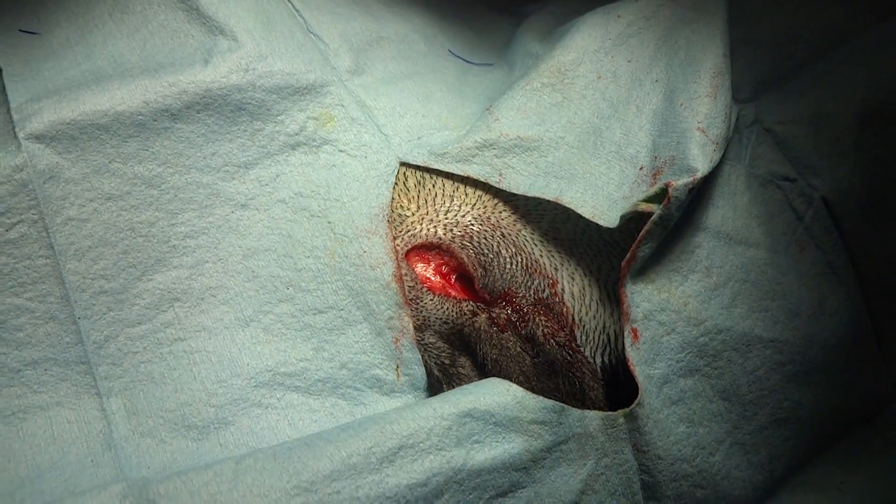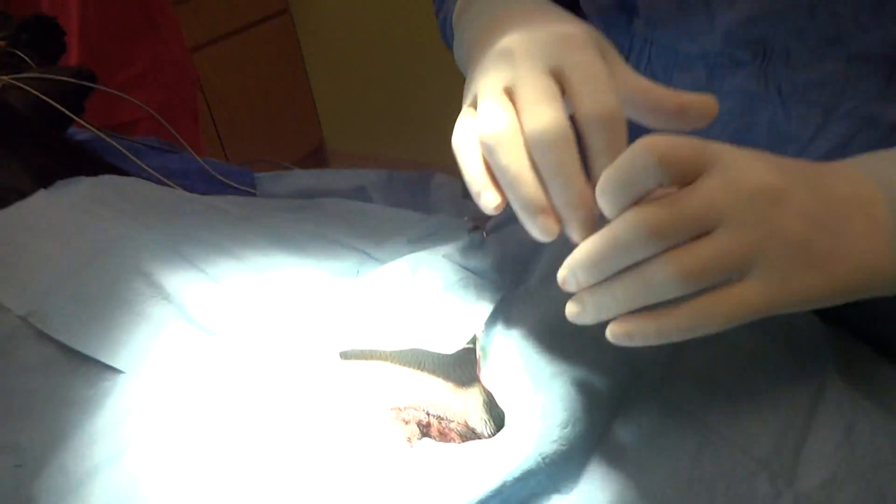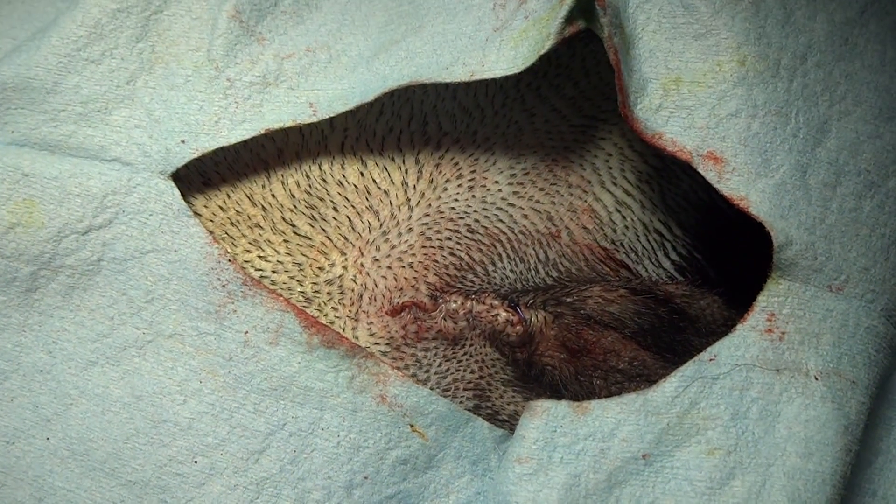So now we'll go ahead and close and our neuter will be finished. Our incision is now closed and as you can see, it closes really nicely with the laser having made the incision. That's a good one.